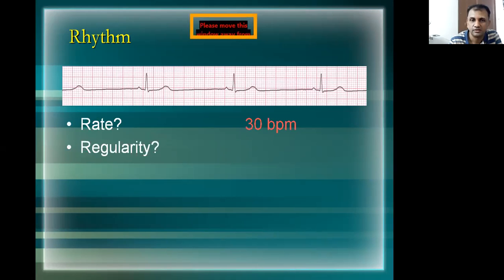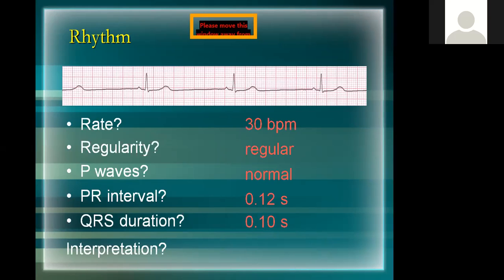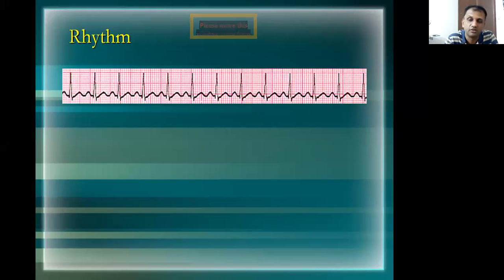Because there is a P wave there, we are going to say it's sinus, but it's severe. Okay. Severe sinus bradycardia. Like the previous ECG, this patient needs admission and close monitoring because they are more likely to have a cardiac arrest soon. Because of severe bradycardia, unless they are on medication which causes bradycardia, we need to stop the medication and keep them under monitoring with ECG tracing or the cardiac monitor. Okay. Coming to this ECG, would anyone like to comment?